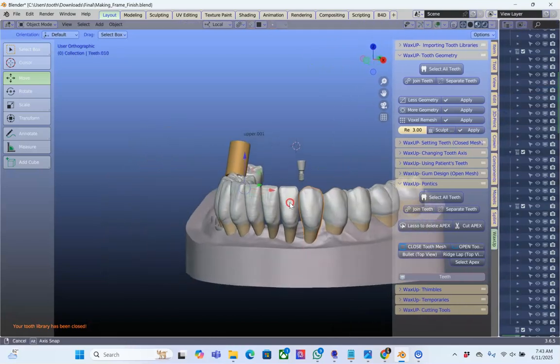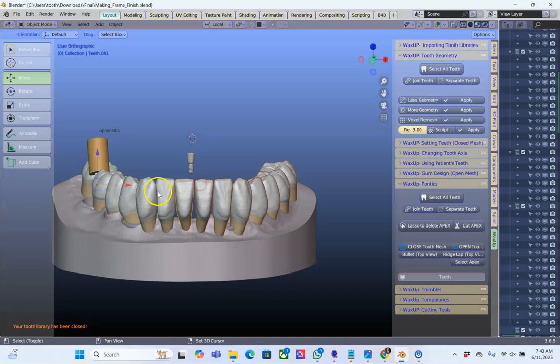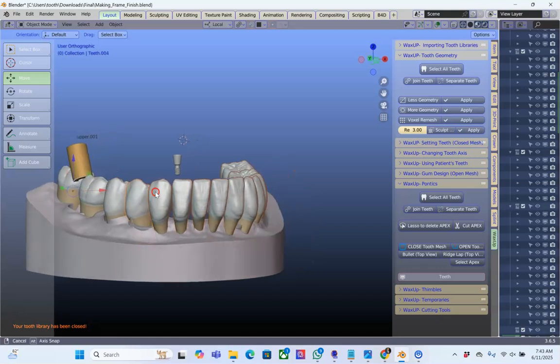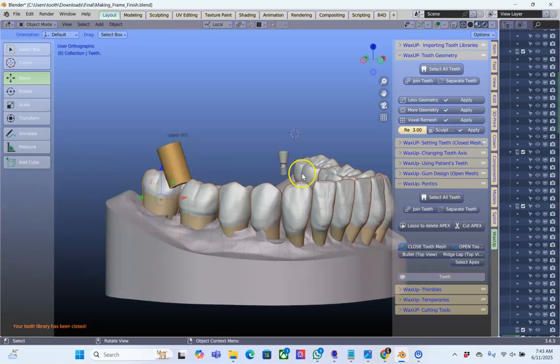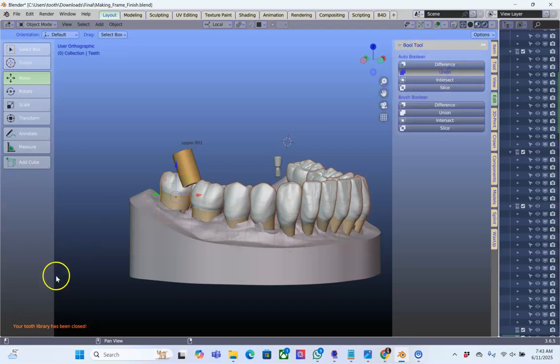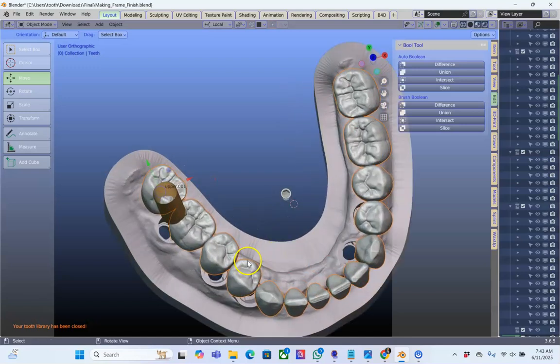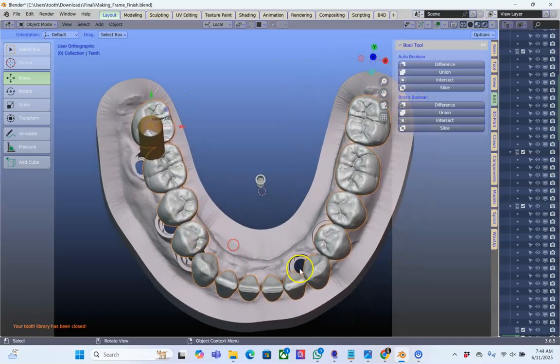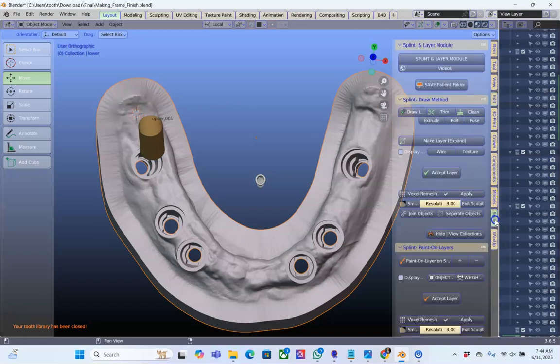Now we need to join these up together if you want to do a reduction frame like we did earlier. So I'll just take these and we can unify them. Edit, Bool Tool, Union. Okay, this is now one piece. I will make some tissues. So I'll just hide this and we're going to draw like in the splint module.